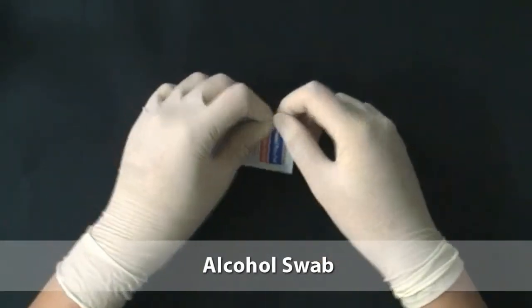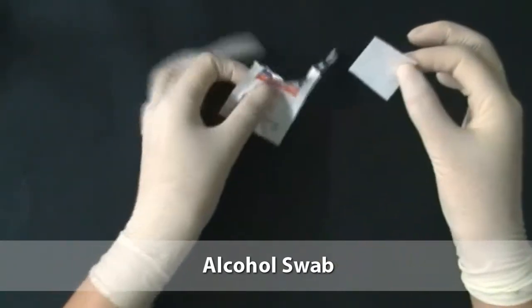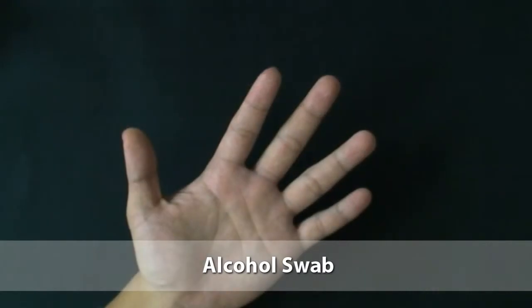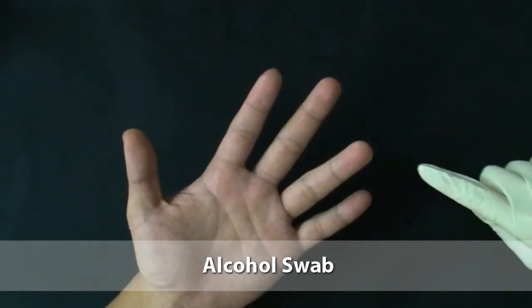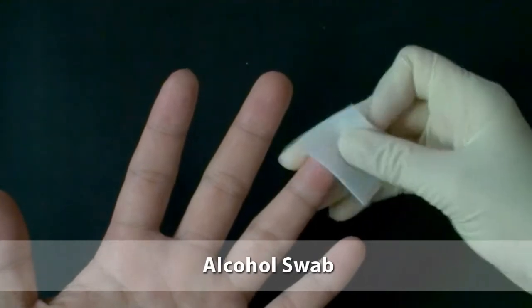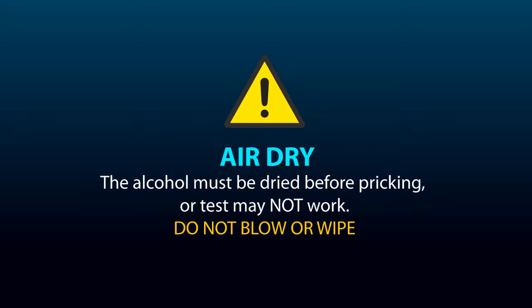Open the alcohol swab. Grasp the 4th finger of the patient's hand and clean the patient's finger with the alcohol swab thoroughly. After cleaning the finger, it must be allowed to air dry. Remember, the alcohol must be dried before pricking, or the test may not work. Do not blow or wipe the finger when you dry.